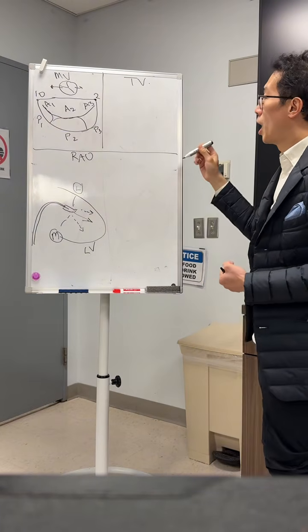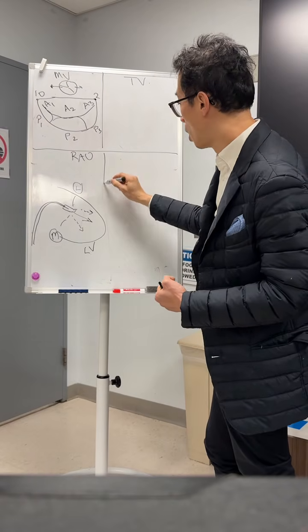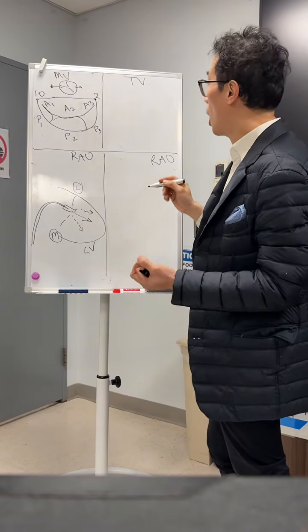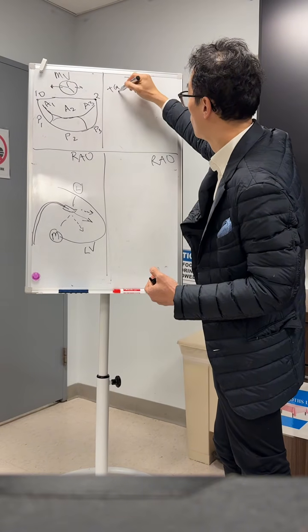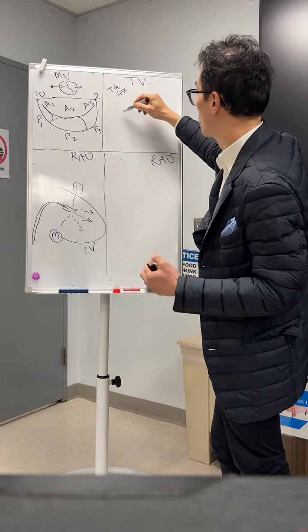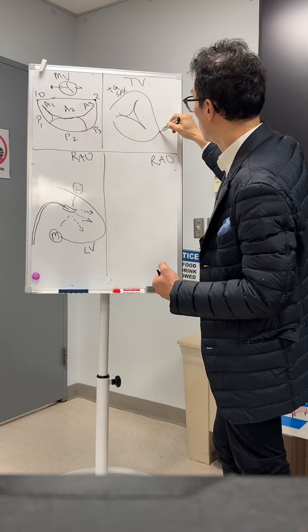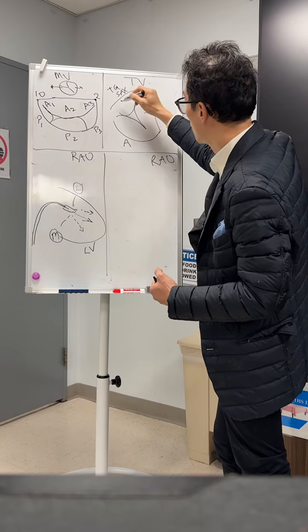All right. So now I'm going to go to the tricuspid side to tell you the equivalence of the same kind of angle trajectory. Tricuspid, because of the thinner leaflet, is harder to do 3D. So what we do typically is a transgastric short axis view. Typically, let's say it's a 3-leaflet morphology valve, it's going to be more like that. So this is septal, this is anterior, and this is typically posterior.